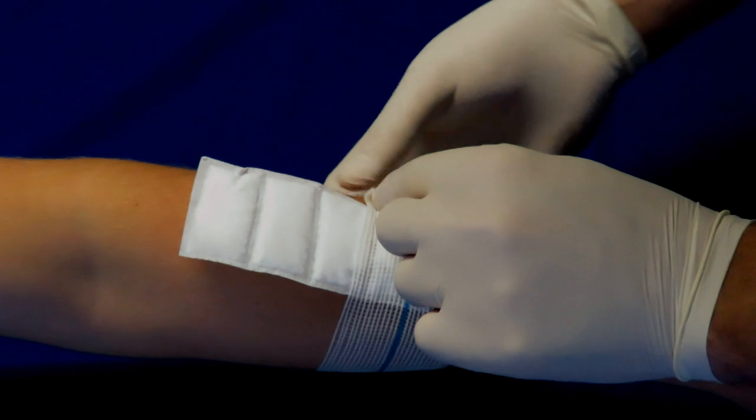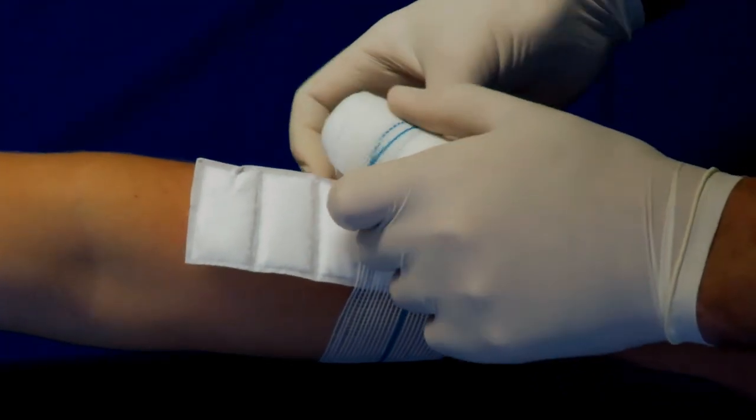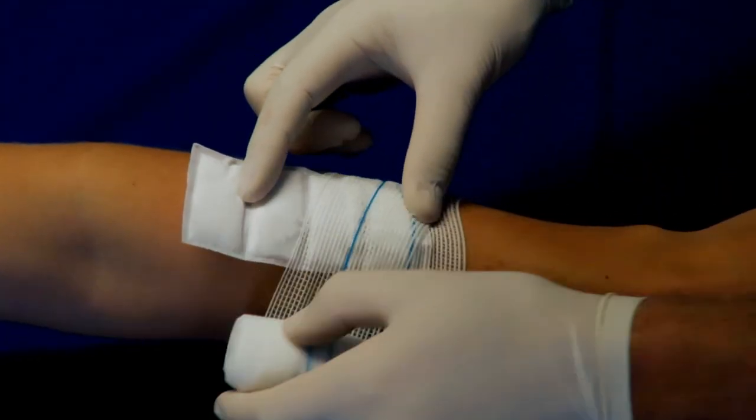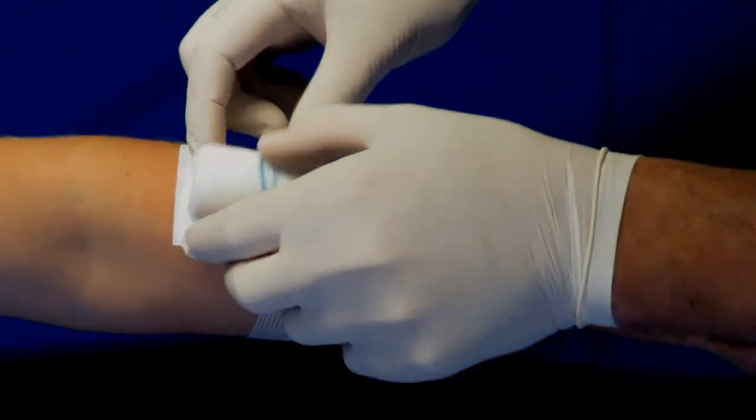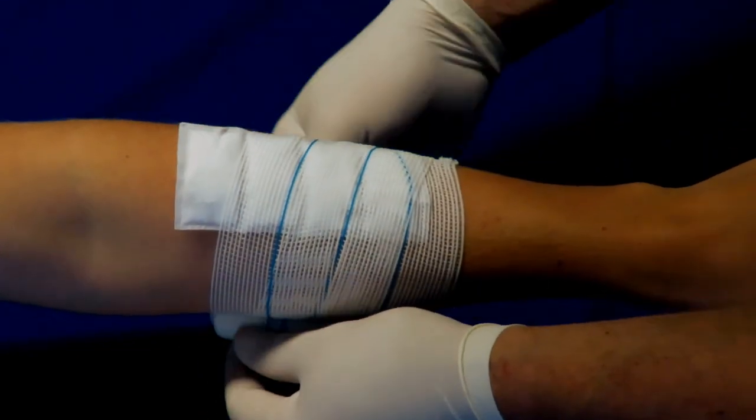To secure the dressing, use a bandage, tape, or a secondary dressing. For fragile or sensitive skin, it is advisable to use a non-adherent product.